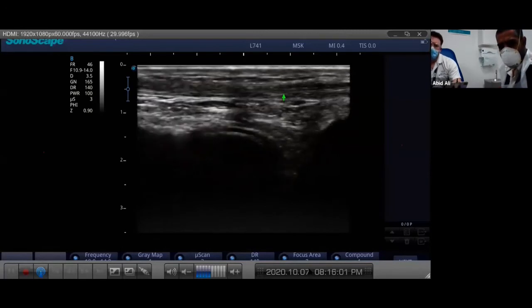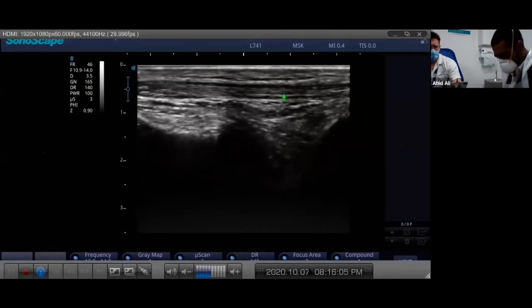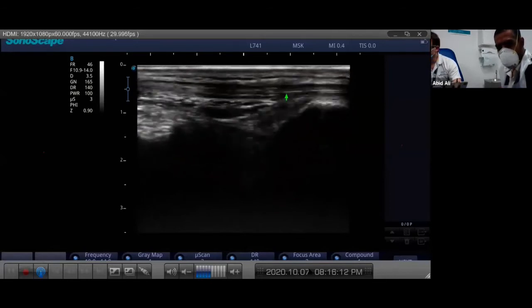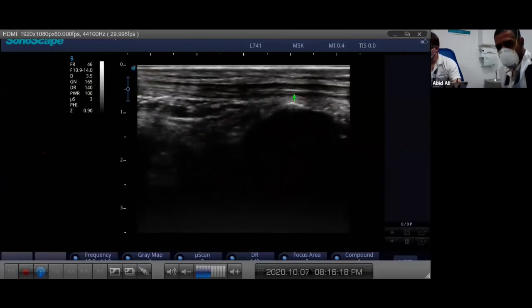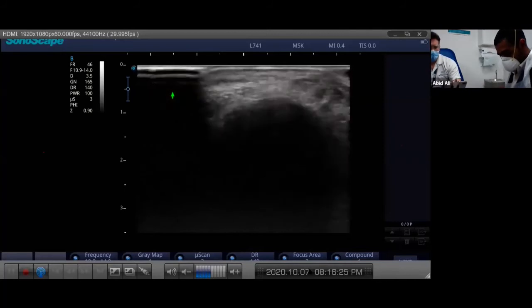Can you see how I'm constantly adjusting the probe very slightly and you can see in real time how that affects the image - very slightly clock-facing to make sure I maintain a good image. I'm also moving very slightly from medial to lateral. This is kind of the textbook image you should be looking for when you're looking at your tibialis anterior.